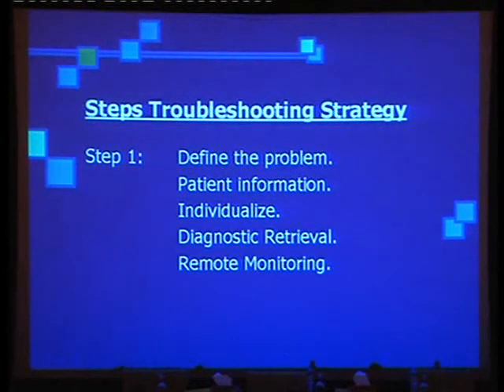After that, we usually or routinely retrieve the information by our programmer. We retrieve the information and the data from the pacemaker to the programmer, and with that we can also analyze what is going on.